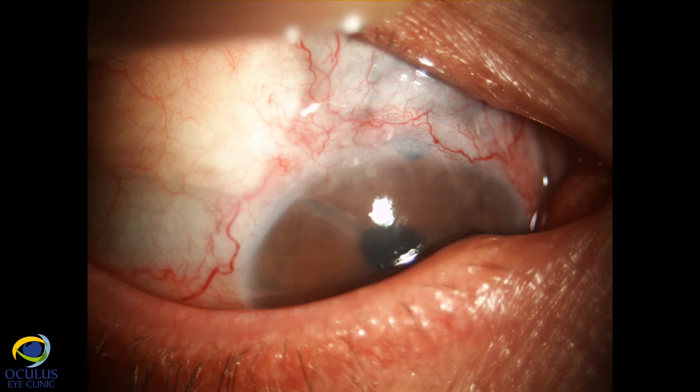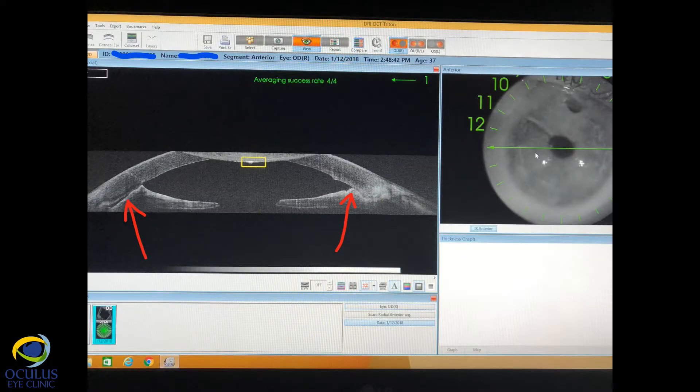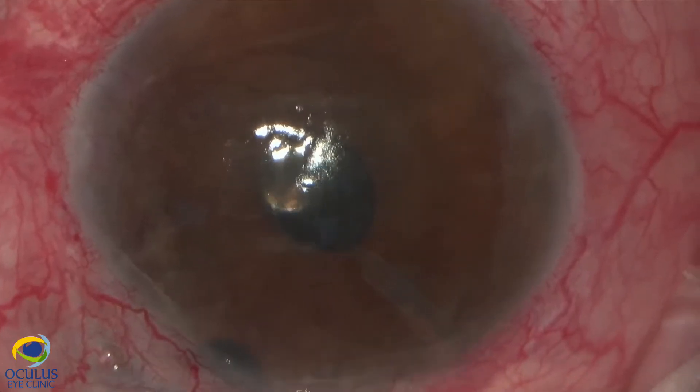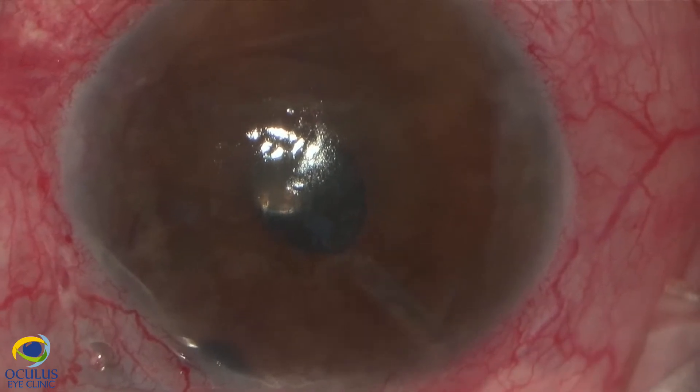We decided in this case for a DSEC procedure instead of DMEK, having in mind the presence of the tube in the anterior chamber and also the extended synechiae between the iris and the cornea on almost 360 degrees, so the angle was completely closed. We performed a standard ultra-thin DSEC.